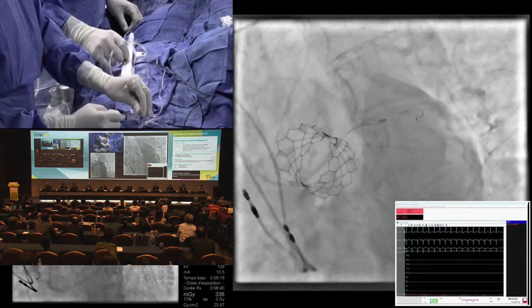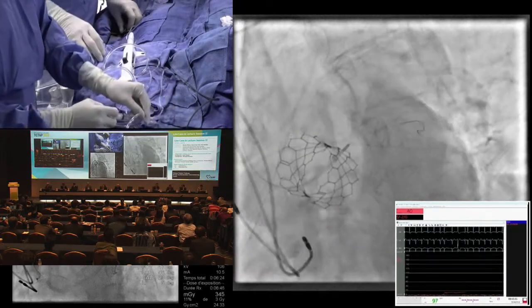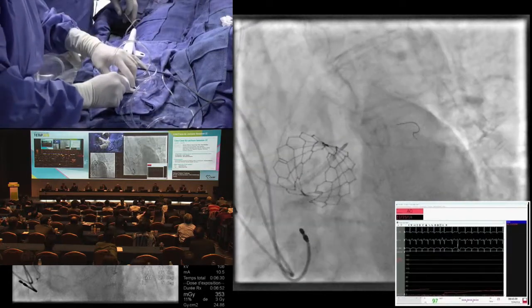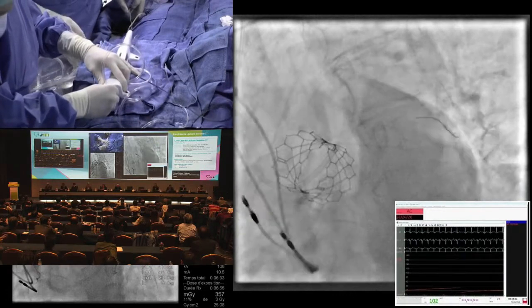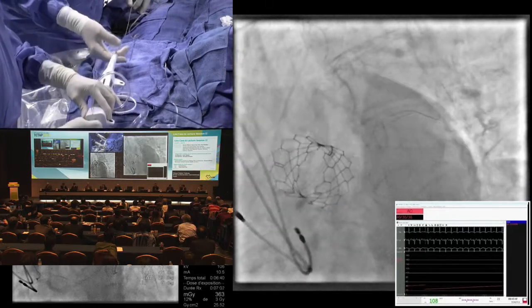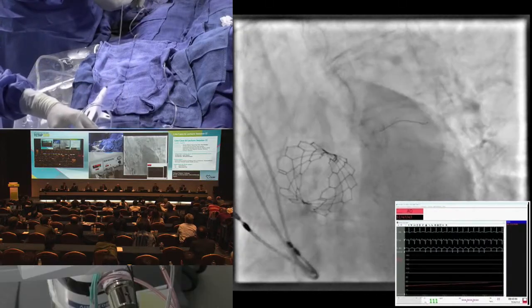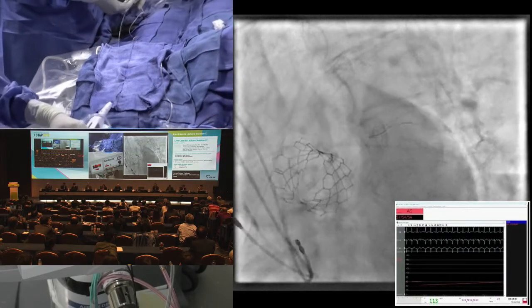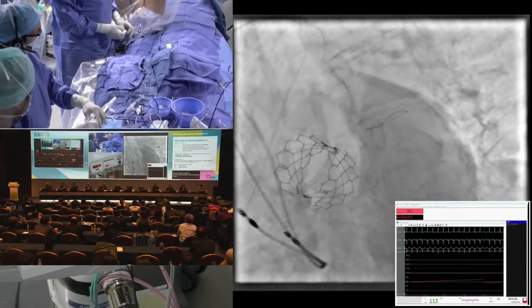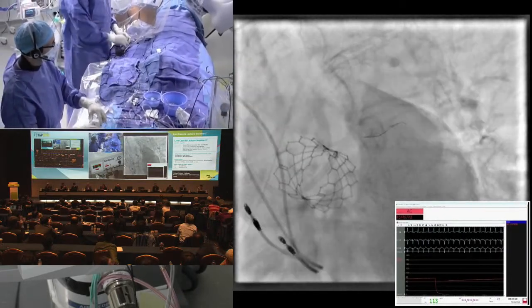Okay, that's fine for the proximal circ. Show the electrode. Okay, ECG is good. And now what we can do is remove the burr. Go on. So Benjamin is removing the burr on the Dynaglide. It's 60,000 RPM during the pullback. There are no ECG changes. For the pressure, the valve is open. We will see the pressure in a few seconds. Okay, that's fine. We are out.